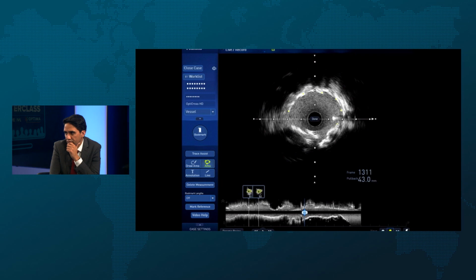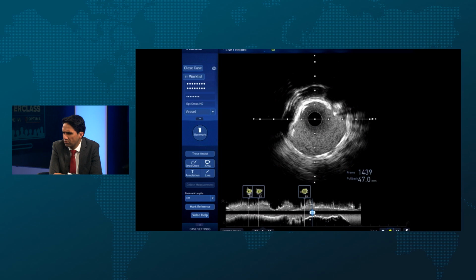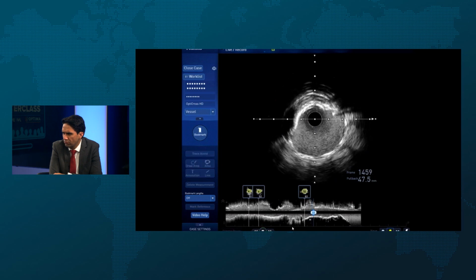Margaret, is there anywhere else you've spotted that needs some post-dilatation? The areas all look quite good. So here's us round about nine, kind of an aneurysmal area, brilliant. That's nice. I think you can't complain about that. Really just the ostium of the LAD.